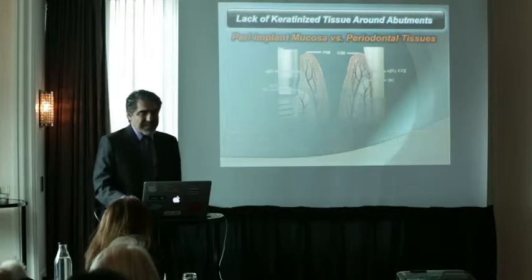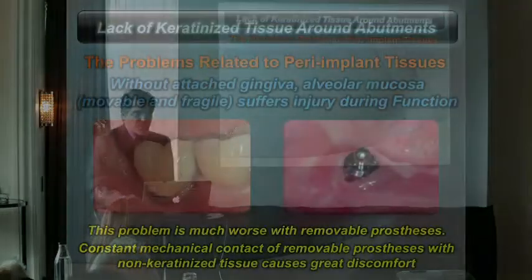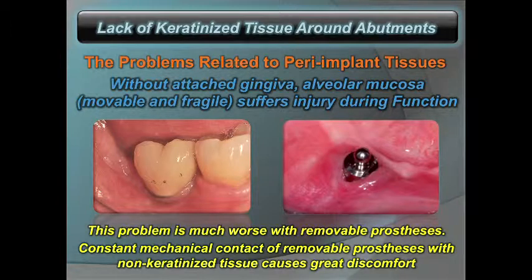Now, the next issue is that if we don't have this tight biological connection between the abutment and the tissue, what is the next available option?